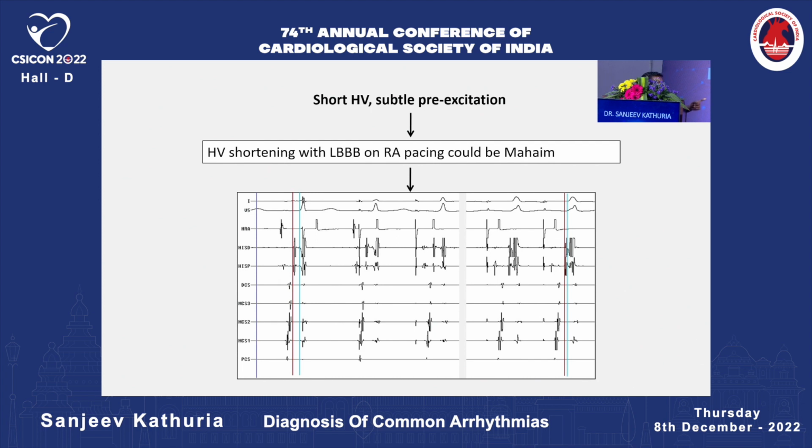Can you appreciate the fifth beat? Your HV has become negative and you induced LBBB. But see, this is again differential site pacing. That means you had to go to another side to pace and then you were able to appreciate it.